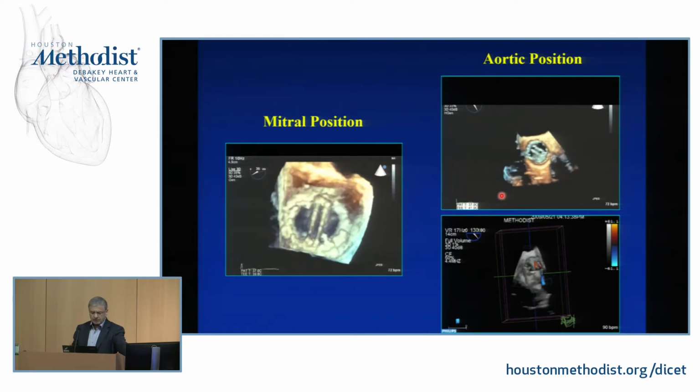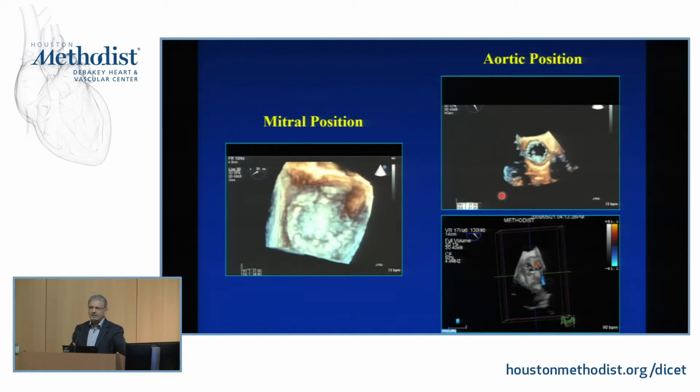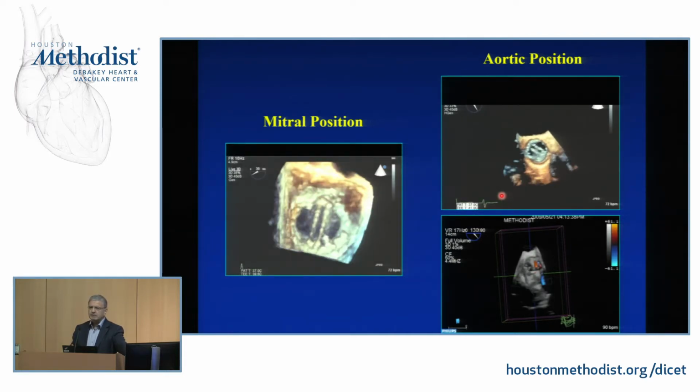In the mitral position, in echo, this was the first time we could actually see the mechanisms of the occluders and everything else. Virtually 100% being able to take a look at a valve, its mechanism, if it is regurgitant, whatever it is, 100%.